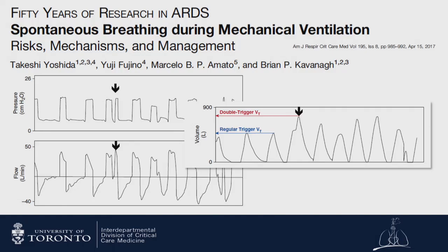Be aware that this example you might easily catch just by looking at the tidal volume tracing, but in some ventilators, this won't show up like this. You'll only be able to detect it looking at the pressure and flow time curves, because the ventilator thinks as soon as it's finished giving one breath and it starts giving another breath, even if that's a double trigger, that's counted as a new breath, and it gives a different tidal volume. Sorry about that. Next slide, please.